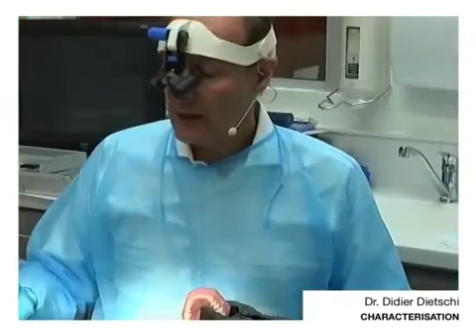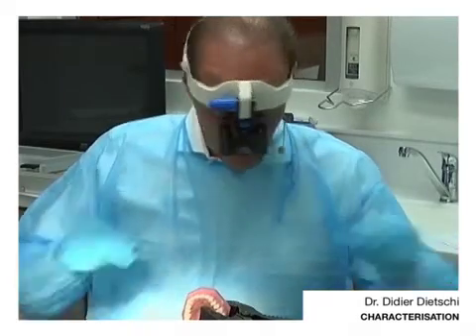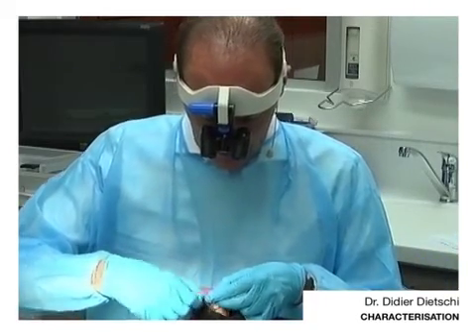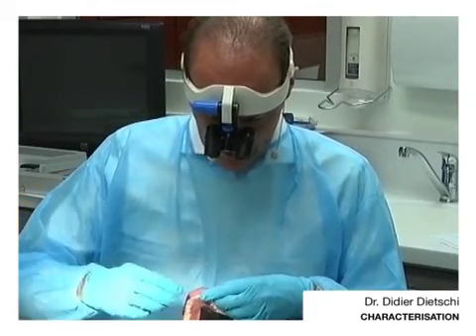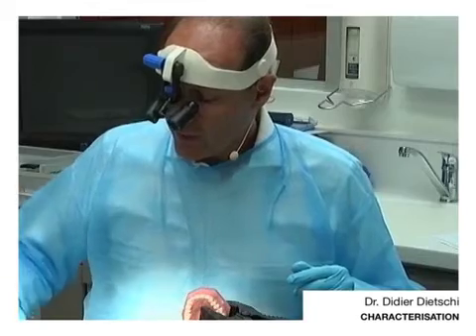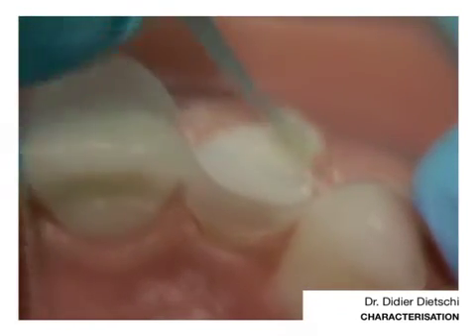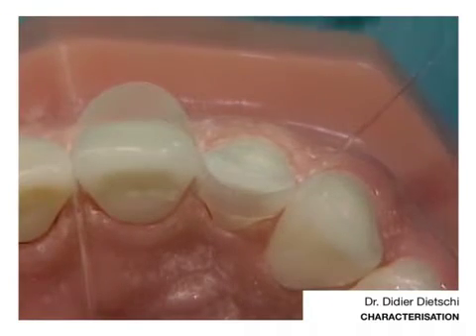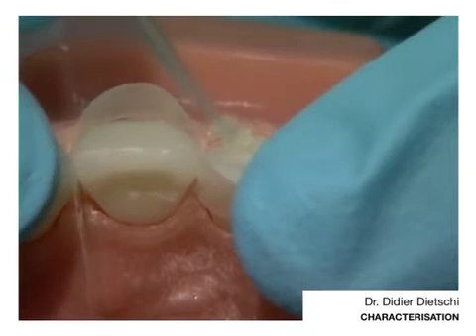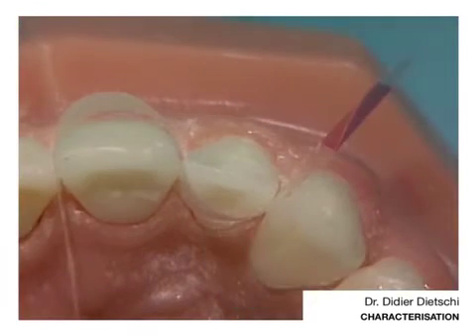I will quickly place again the strip so that I don't put any uncured resin or anything on the surface of the other veneer. That's very important. Never go with the next veneer without protecting the previous one, because otherwise everything — especially if you have a little bit of bonding or composite — might really contaminate the surface of your veneer.